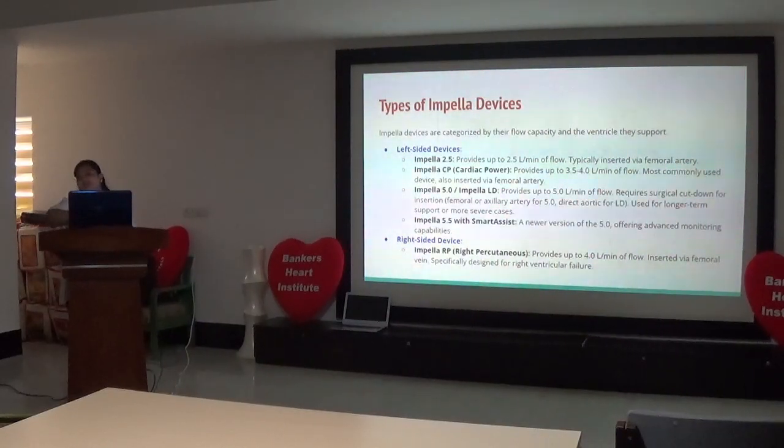In IABP, the blood has already been pumped into the ascending aorta, and the inflation and deflation of the balloon is going to cause counterpulsation and pressure that is going to help in systemic perfusion. So first was IABP, but then much better is Impella.